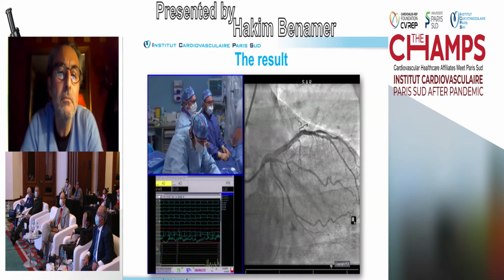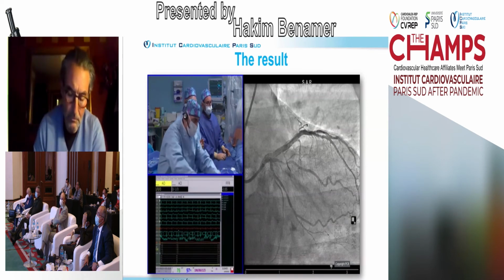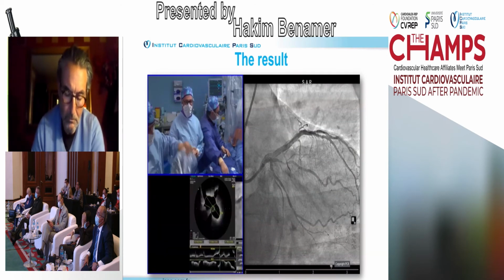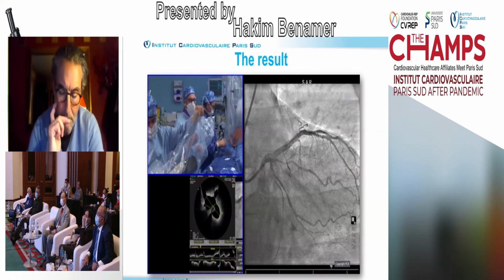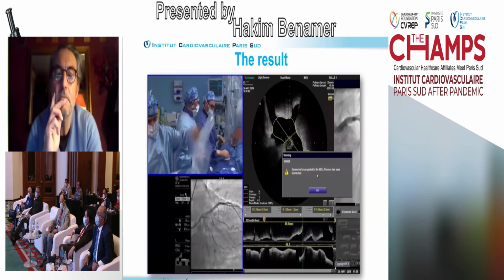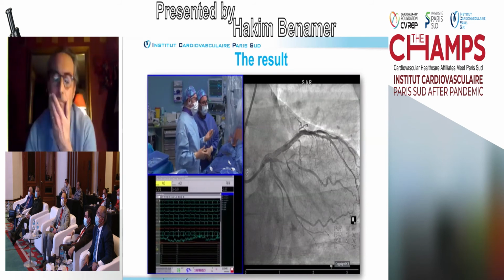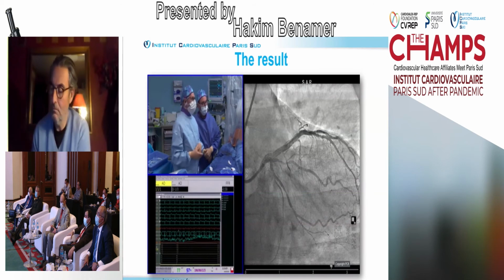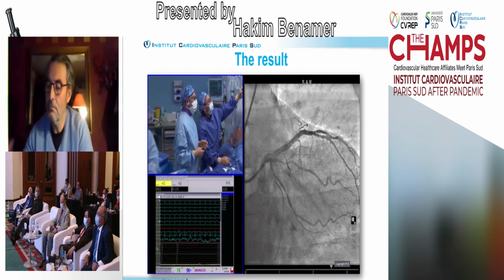And then we realize that we should explain and show why we can do it without OCT, because looking at the angio, we are able to see that the distal left main is involved in this lesion. We cannot avoid treating the left main. So the purpose was just to show by OCT that you should treat the left main. Of course, FFR was on board, and it was very important because if you have to treat the intermediate branch, you have to treat the third branch, it's a completely different story. So now we can show the final result, and then we go back to react.